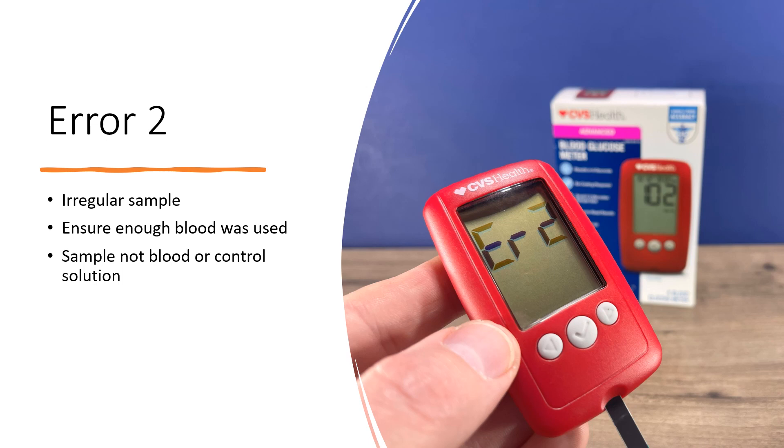Error two means an irregular sample — either not enough blood was used, or a liquid other than blood or control solution was applied.